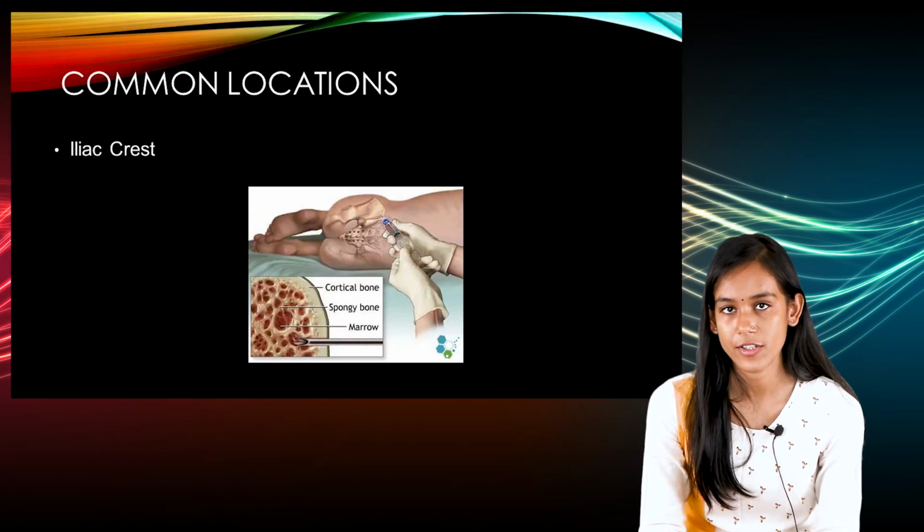So next, let us learn the common sites from where we can collect bone marrow. The first and most preferable site is the iliac crest.